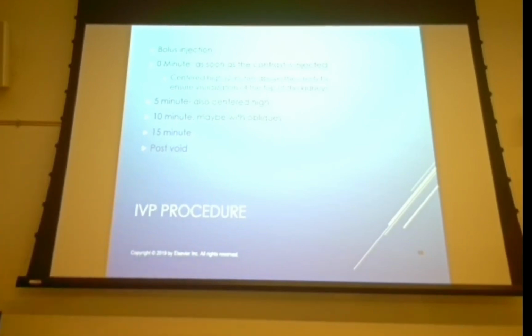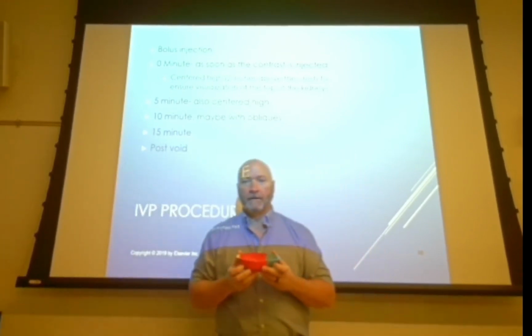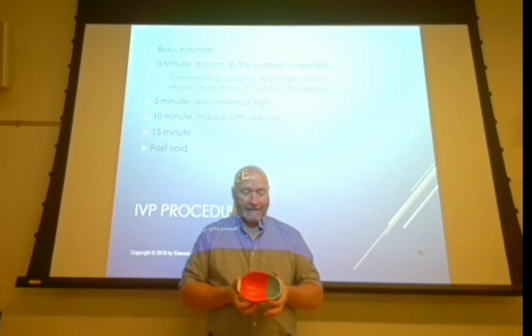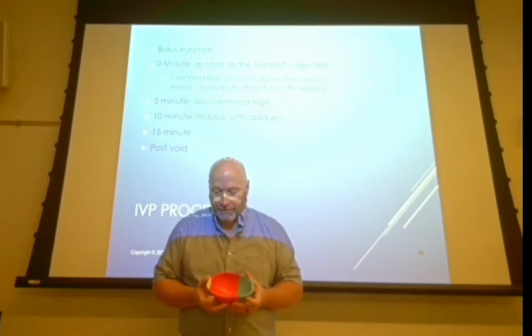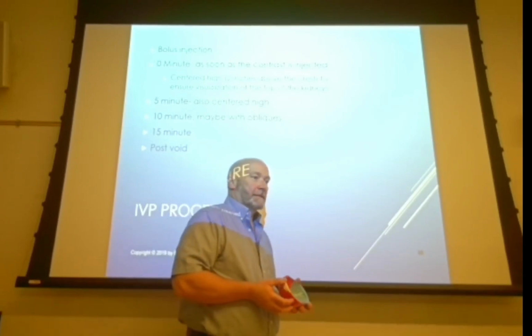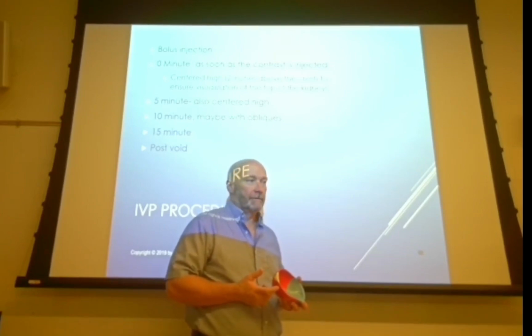The other thing that the obliques show is a better bladder. All right, so where do the ureters plug in? Towards the bottom, posterior side, right? So at the same time as you oblique, you get your ureteral insertion here, right? As I oblique up, what happens to the side that's furthest from the image receptor? You're going to see it a little bit better?